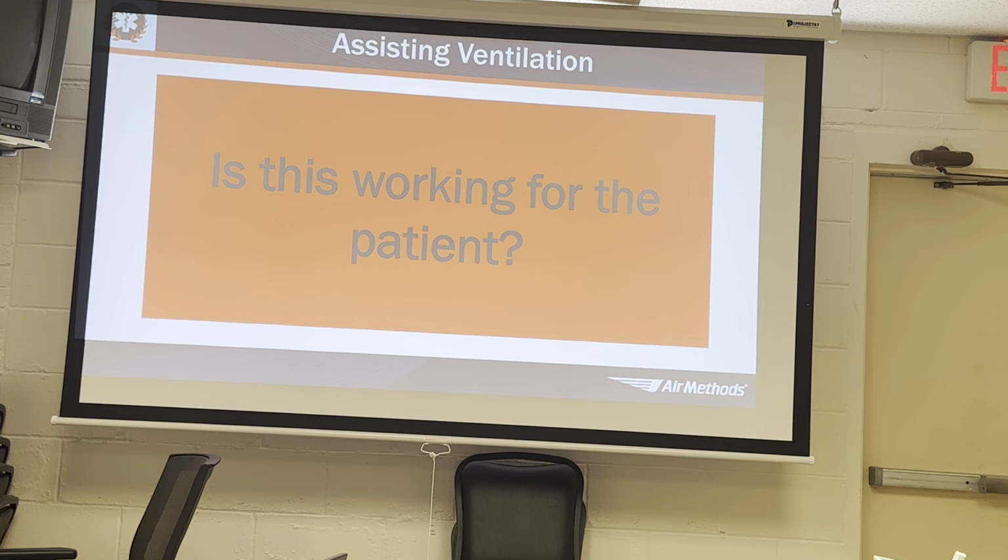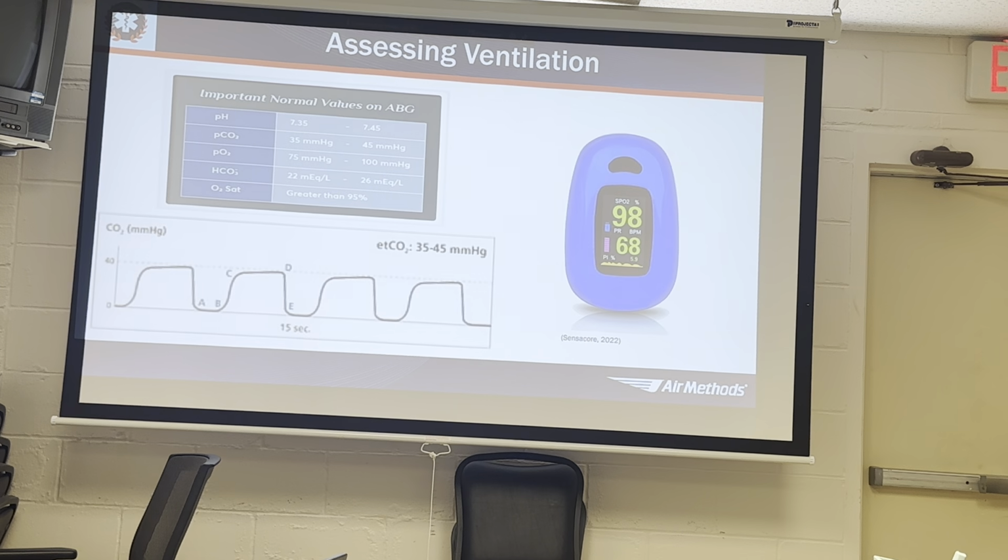Assisting with ventilation: is this working for the patient? We already talked about that. Assessing ventilation: end-tidal CO2 is a huge help in detecting whether or not we're well ventilating a patient. If I set a patient up on a ventilator and I've got my end-tidal CO2, I want to see them between 35 and 45.